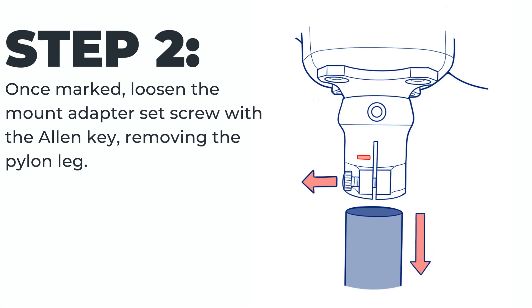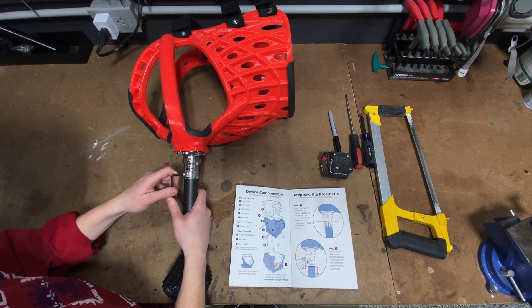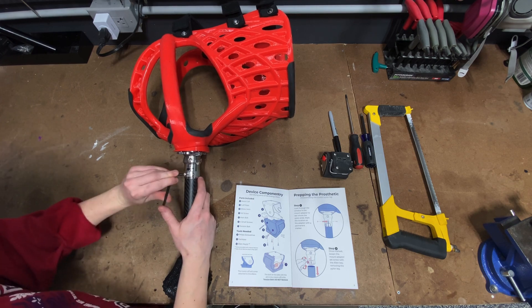Step two: once marked, loosen the mount adapter set screw with the allen key, removing the pylon leg. Don't take the screw all the way out — just loosen it enough that there is a gap in the adapter and the pylon slides out easily.